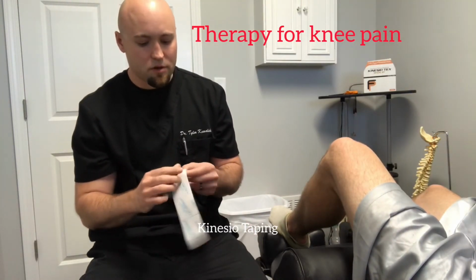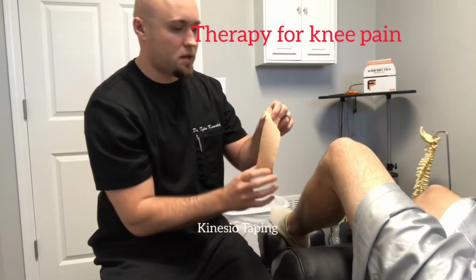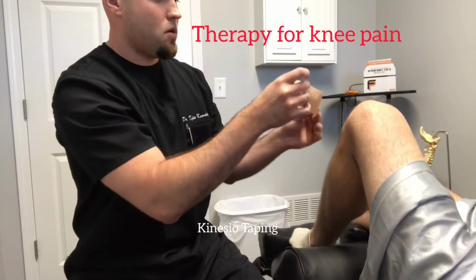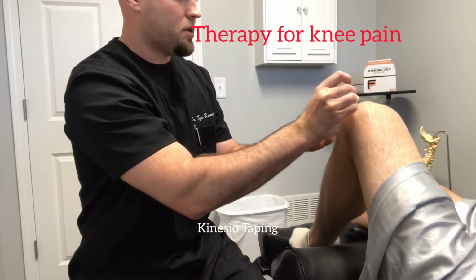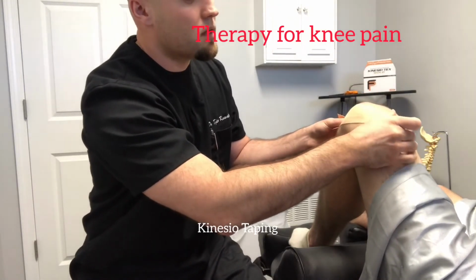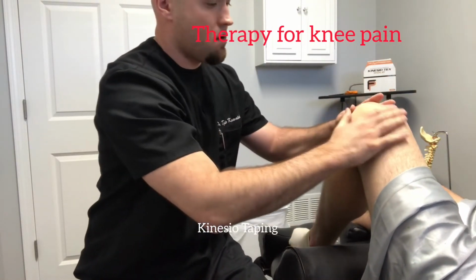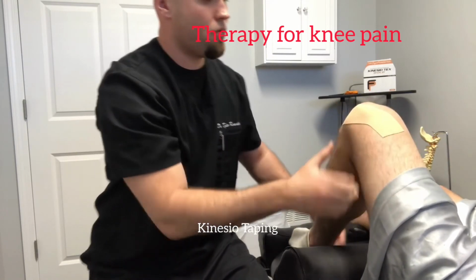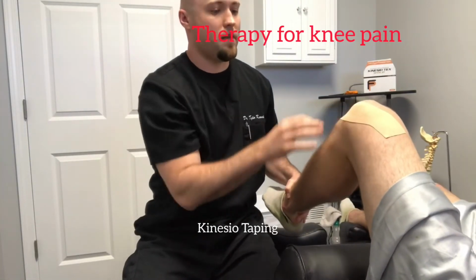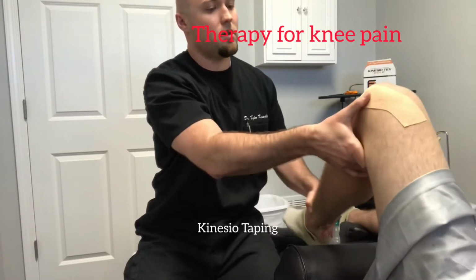With this Kinesio Tape, it's great because it has flexibility and stretch in it, so it's not going to limit your movement, but it's going to give you some stability. So I'll have the patient flex the knee up. We'll follow it right on the lateral side, pulling that kneecap back in just a little bit, all the way around here. That way, when that runner or athlete is moving and running, it's giving that lateral support on that knee, so that patella isn't flaring out on the lateral side of the knee.